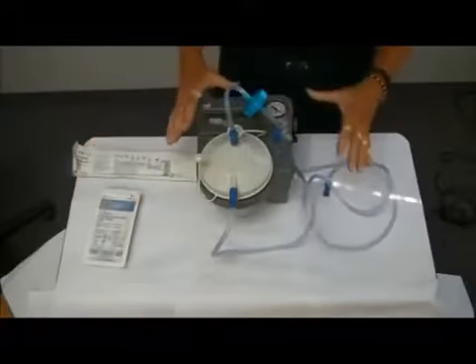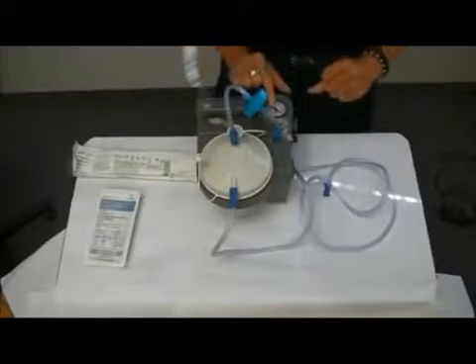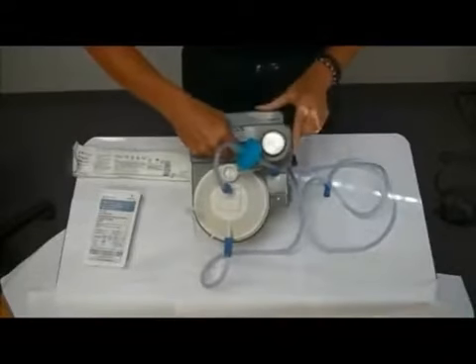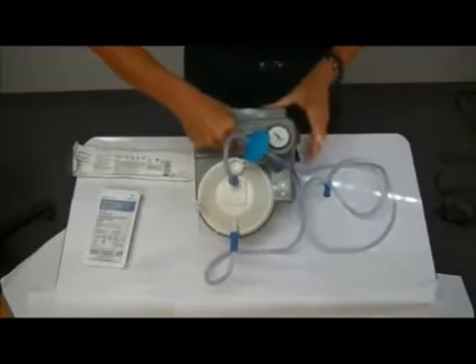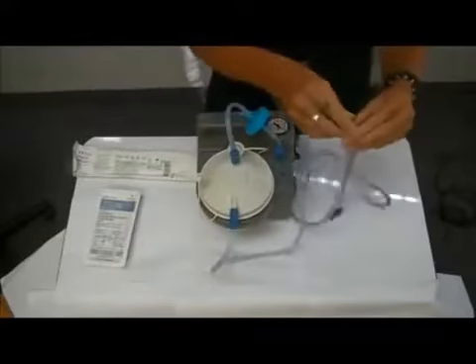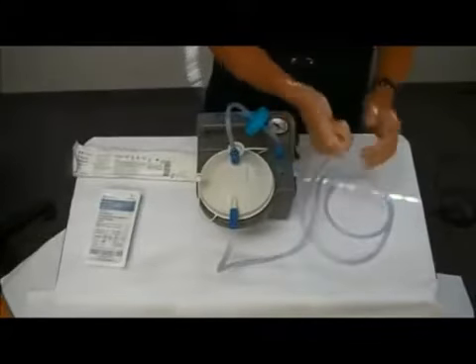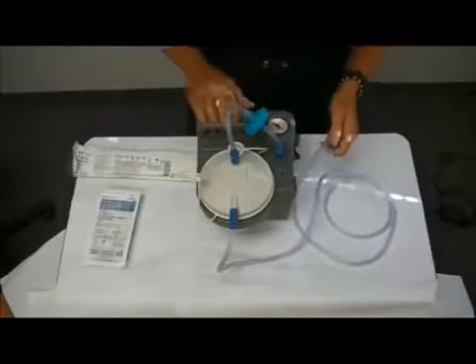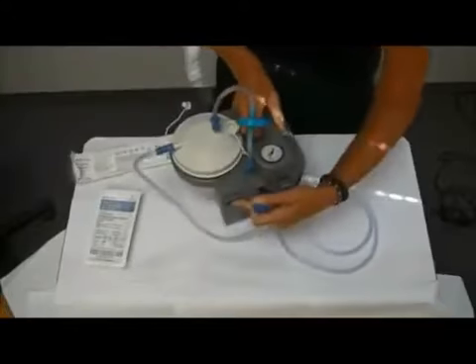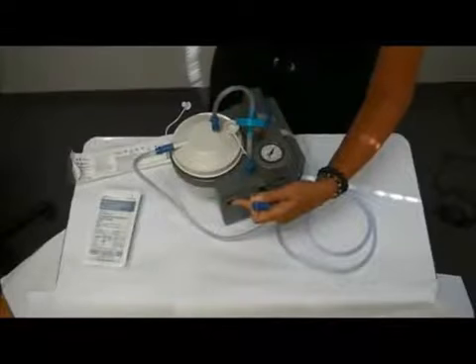Once you get everything connected, you can turn the machine on and check your suction pressure. There's a gauge right on the top of the suction machine where you'll be able to read the suction pressure once you turn it on. You will need to crimp your hose or plug the end of your tubing in order to read a pressure on the machine. On the side of the machine is your on-off switch, so I'm going to turn the suction machine on and show you how to adjust the pressure.